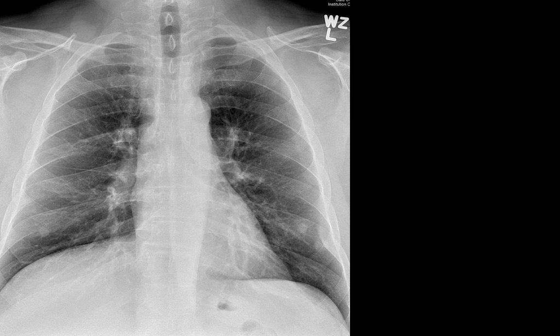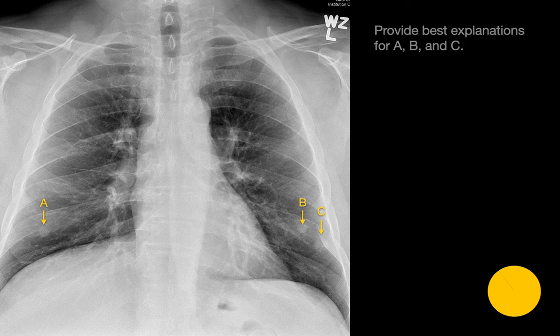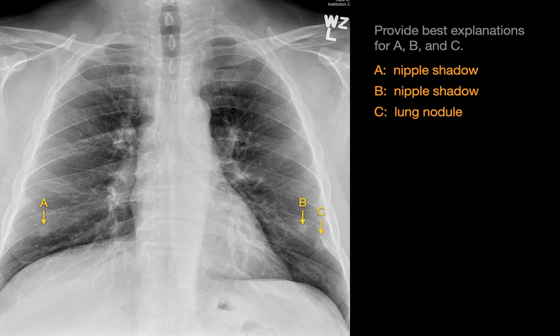There are three nodular opacities on this chest radiograph. What's your best explanation for each one? Nodular opacities A and B are both relatively round, well-circumscribed along their medial, lateral, and inferior margins, but their superior margins are indistinct. They're also relatively symmetrically positioned. All of these features are characteristic for overlapping nipple shadows. Nodular opacity C has an oblong appearance and is circumscribed all 360 degrees around and suspicious for a lung nodule.